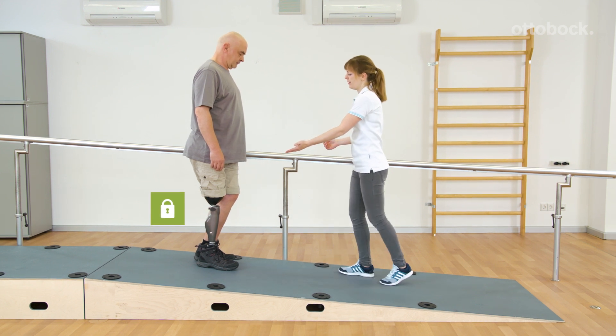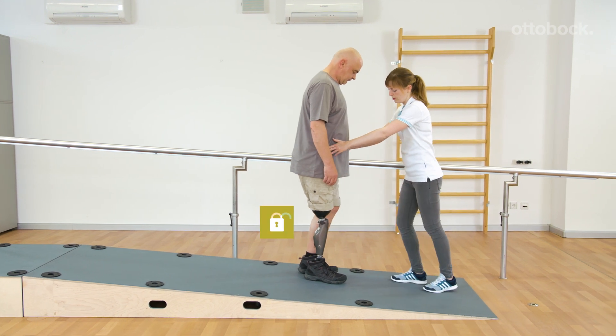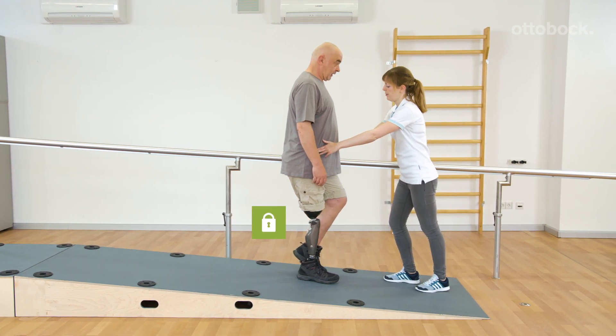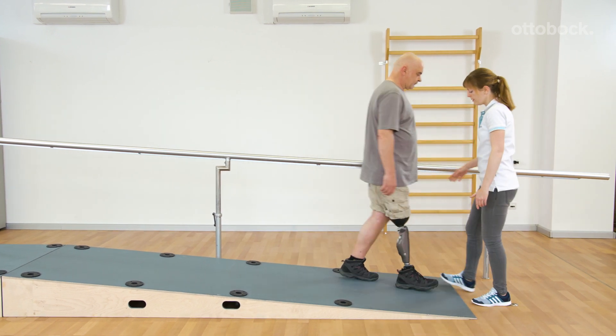On the shallow slope, Gerhard practices standing and starting with the prosthetic side, as well as starting with the contralateral leg using stance release.